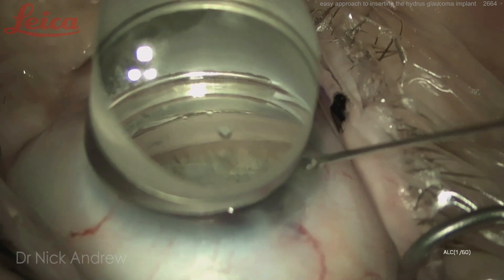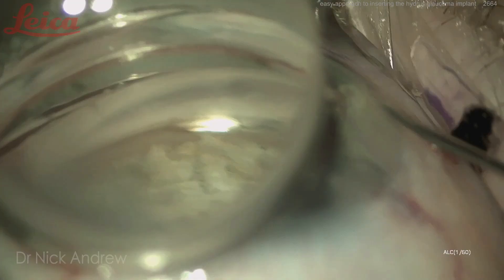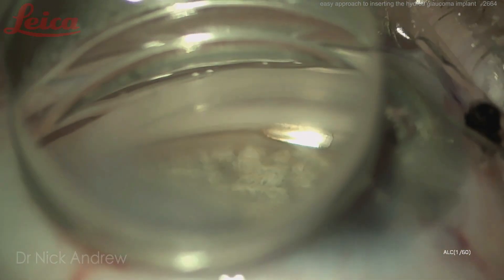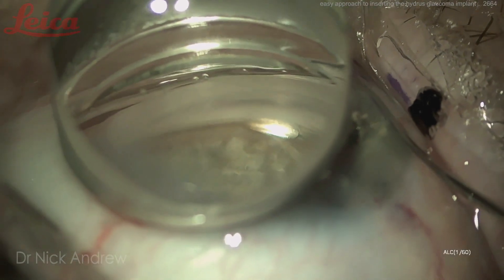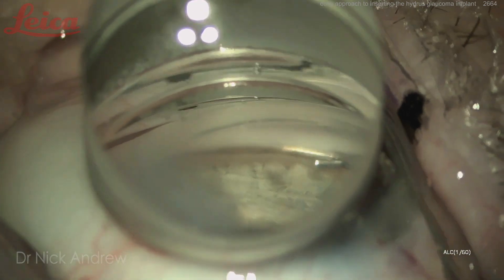Here's a demonstration case. I'm piercing the trabecular meshwork as far to my right as possible — even up under the upper eyelid. Open the speculum more widely; you don't want the speculum pressing on the limbus. Pushing forwards, I want the distal one third of the Hydrus injector buried beneath the trabecular meshwork, well and truly seated deep in Schlem's canal. Relaxing the hand — see the eye starts to come around to a more neutral position. Now taking away all external pressure against the limbus, eye in a neutral position, and a steady delivery.